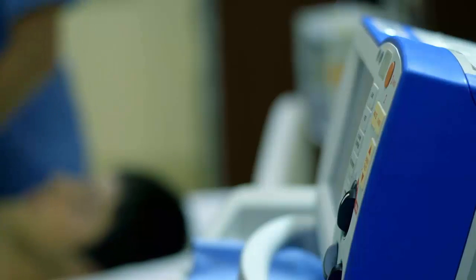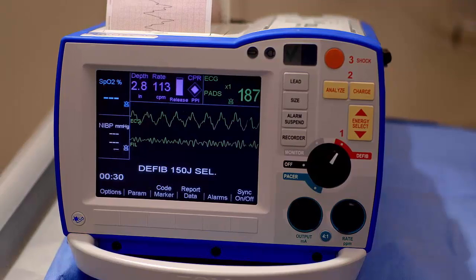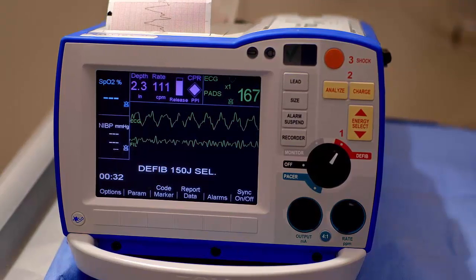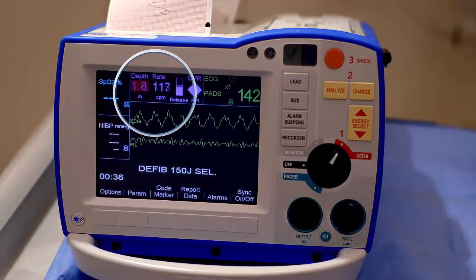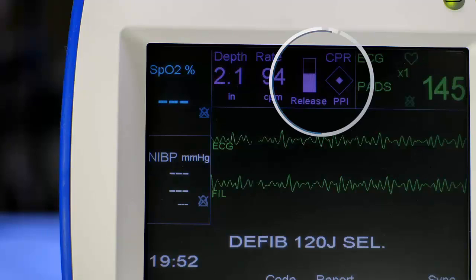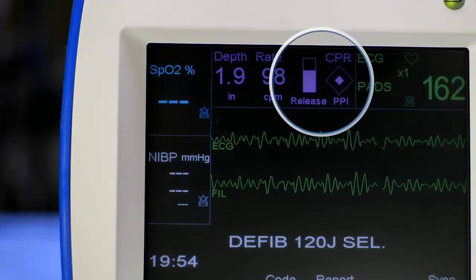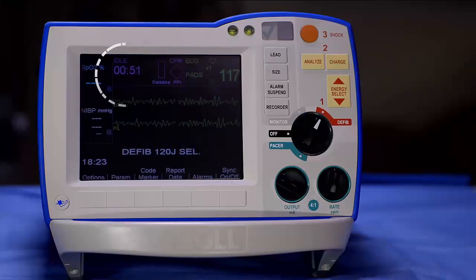You should always use a backboard or CPR mattress when administering CPR. For adult patients, real-time feedback displayed on the CPR dashboard includes compression depth indicator, compression rate indicator, release bar, perfusion performance indicator, PPI, audio and messaging prompts, and idle timer.